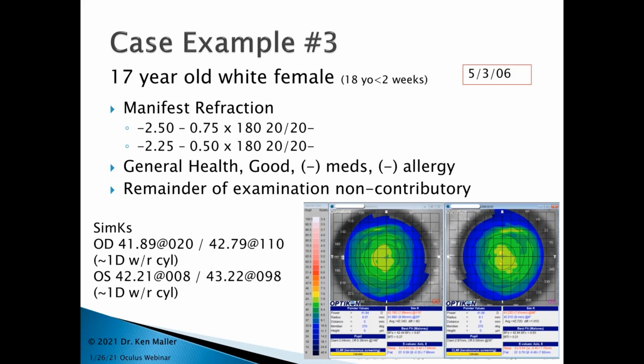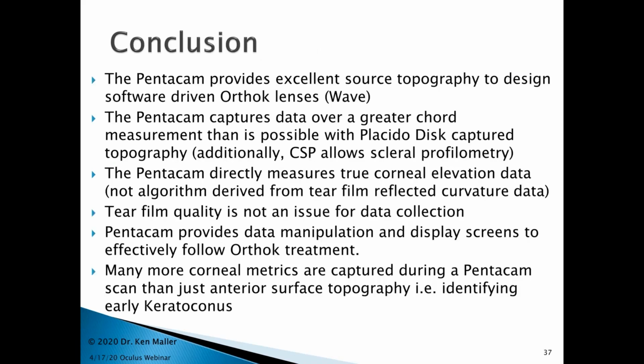So to conclude, the Pentacam provides excellent source topography data to design Ortho-K lenses using software like Wave. It captures data over a greater chord than is possible with the Placido disc. And additionally, if you have the CSP software, you can get all the way out onto the sclera for scleroprofilometry. The Pentacam doesn't measure reflected curvature data such as the Placido disc-based systems. It's measuring true corneal elevation data.